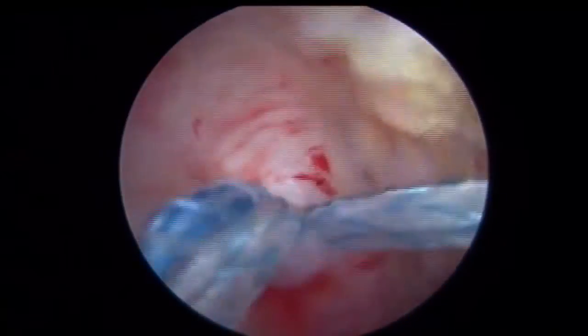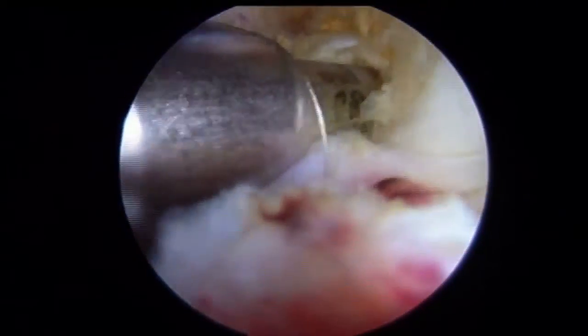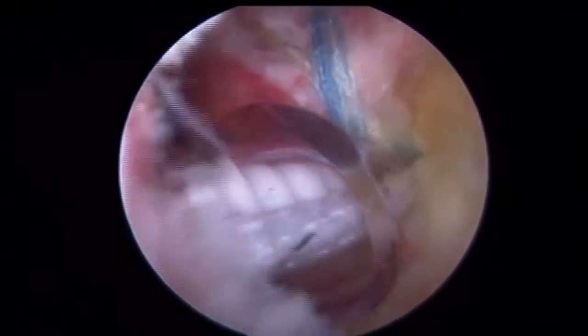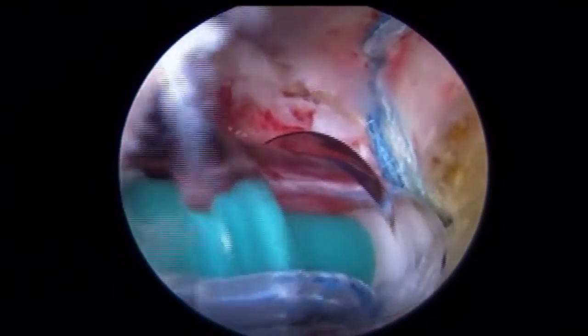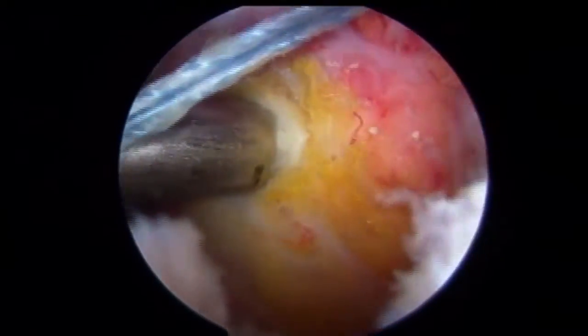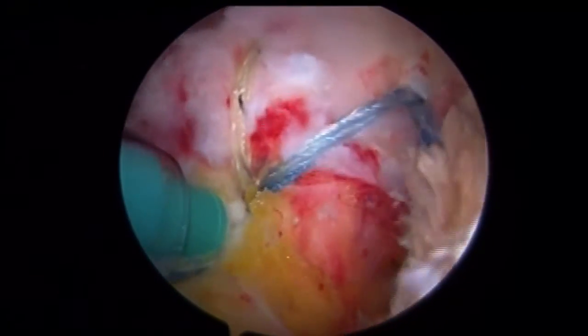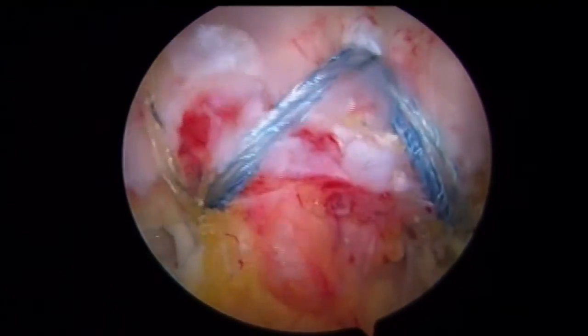One limb from each anchor is retrieved through the lateral portal. Soft tissue is then cleared approximately 5 to 10 millimeters lateral to the edge of the tuberosity in preparation for placement of the lateral row anchors. Both limbs are loaded through a third knotless anchor, which is then placed anteriorly, one centimeter lateral to the tuberosity. After the threaded portion of the anchor is advanced to bone, the sutures are tensioned and the anchor is seated. The free ends of the suture are then cut. This process is repeated with the remaining two limbs of suture tape to create a posterior fixation point for the lateral row. The resulting repair is self-reinforcing and interconnected, allowing for excellent repair of the rotator cuff defect.